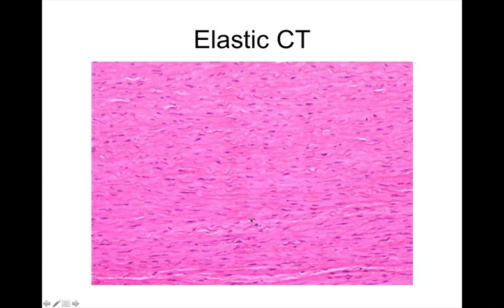Yeah, and once you clue in on that wavy appearance, basically going left to right, then it becomes more clear. Yeah, I think our stuff actually looks better because it picks up the stain a little bit better. But that's great. So it's sort of this little interspersed collagen with that wavy elastic. And I think they also have a specific kind of direction they go in, more or less.